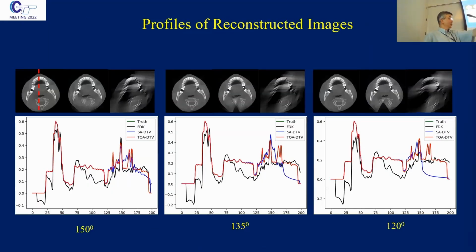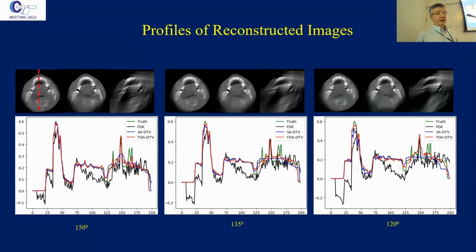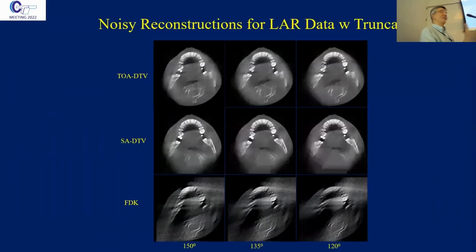Oh yeah, we noticed that. Can you say something about that? I don't know. It's just that once you have noise, what are you solving? What you have is the summation of the model and noise. You cannot separate them. So basically you are using an iterative process and you apply that to this combined thing.